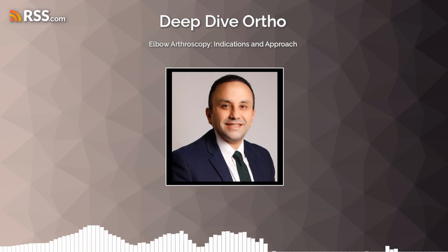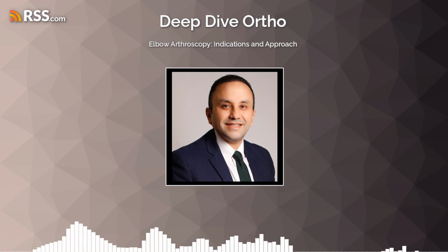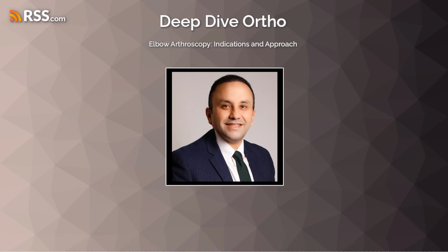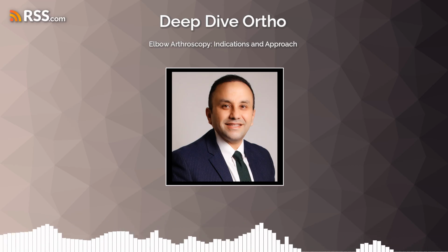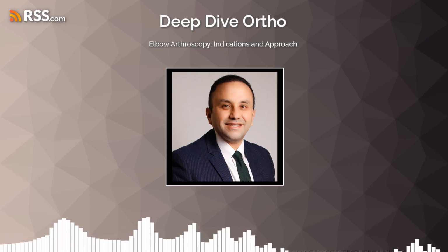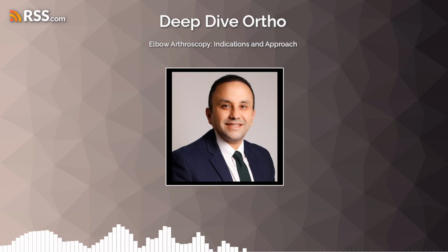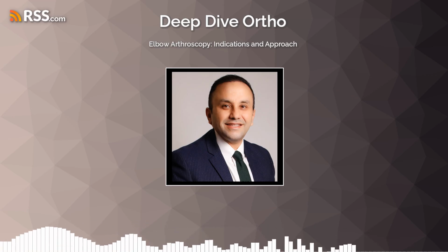For complete tears or tears greater than 50%, an endoscopic repair can be performed. The anatomic footprint on the radius is identified and debrided endoscopically. Techniques like the endo-button method described by Sharma and McKay involve delivering the ruptured tendon, suturing it to an endo-button, and using the endoscope to guide reaming and secure the button onto the radial tuberosity, confirmed with fluoroscopy. This allows for a very strong anatomical repair.